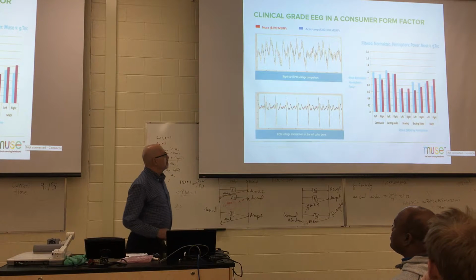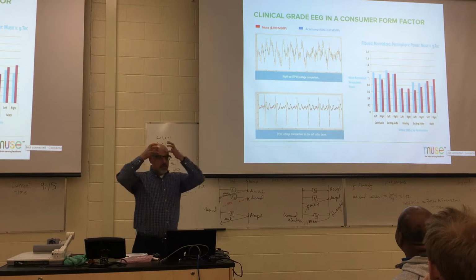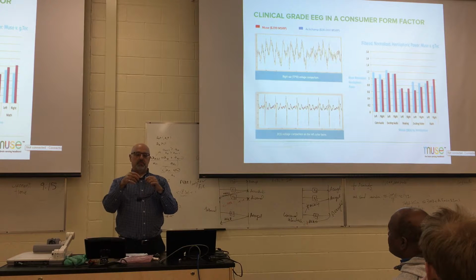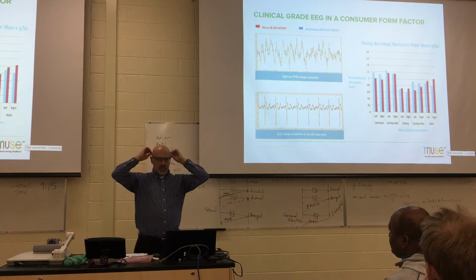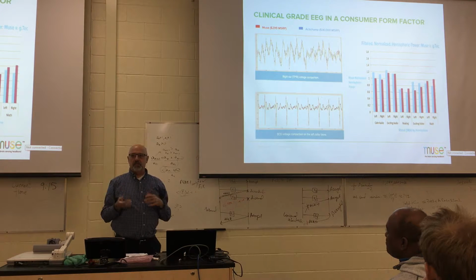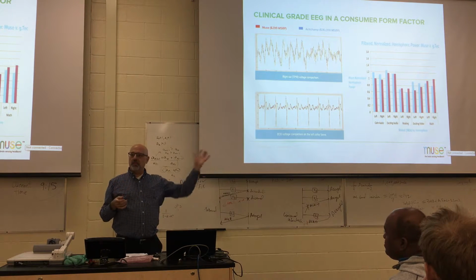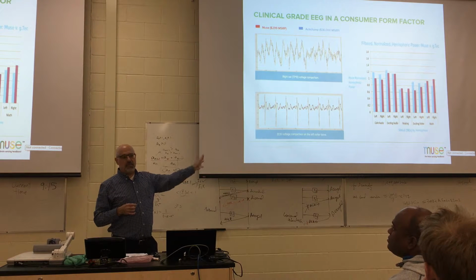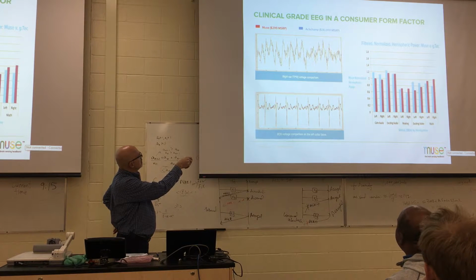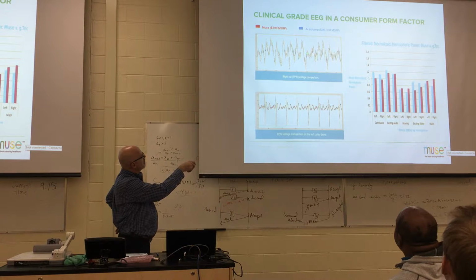So here's a comparison of the Muse. What we did was we took a full cap, and at the same time we stripped out all the plastic casing off of that and just put this flex band, and we're able to put the Muse underneath the cap. We recorded in 2 places very close together, and we compared the signal that the Muse was getting to the signal of that very expensive full cap conductive gel EEG system. You can see here that the Muse is red and the clinical grade is in blue, and you can see how well the two corresponded.